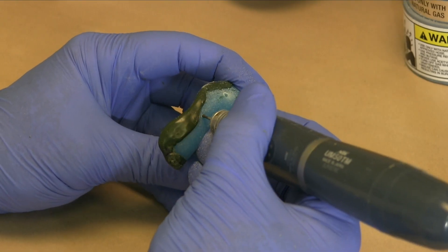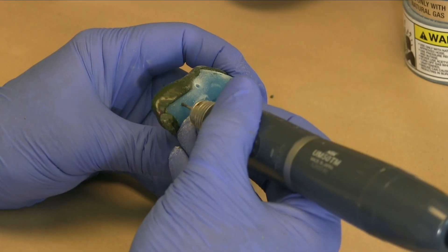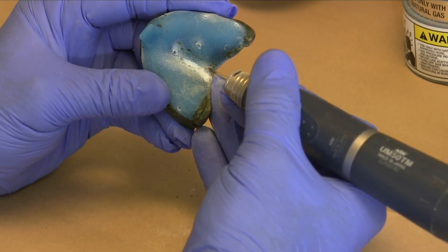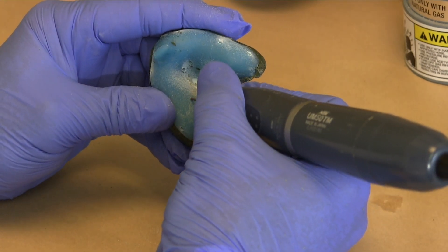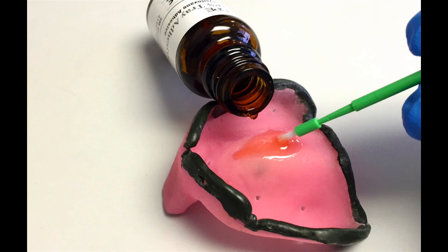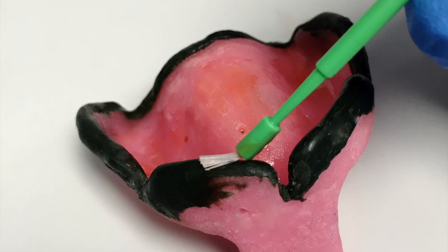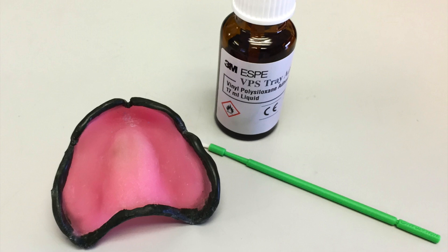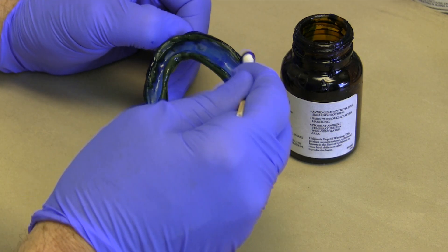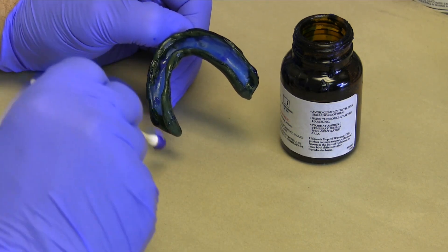Place a number of holes in the custom tray using a number two round laboratory burr. These holes will allow release of hydraulic pressure to minimize displacement of movable tissues during the impression. They will also help retain the impression in the tray. Coat the impression tray with a very thin layer of adhesive and allow it to set for a minimum of five minutes. Use small disposable brushes or cotton tip applicators. There should be no pooling of adhesive on the tray — a thinner layer is actually more effective than a thicker layer.